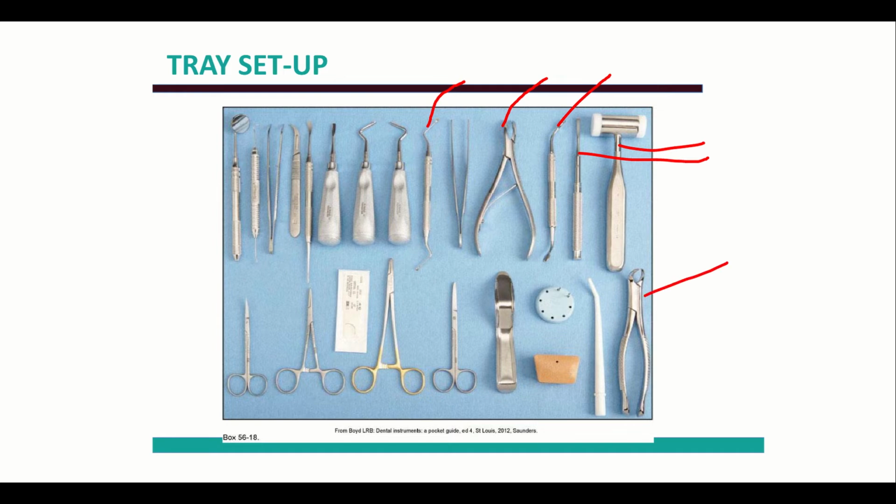You can see here's the cow horn forceps. We might need burrs because we might need to do some drilling to get the bone away from the tooth. We've already talked about a surgical suction tip, bite block, Minnesota, cheek, tongue, lip retractor. These are tissue scissors, and then these are suture scissors, where we're going to put the suture in that holder, and then tissue scissors over here.